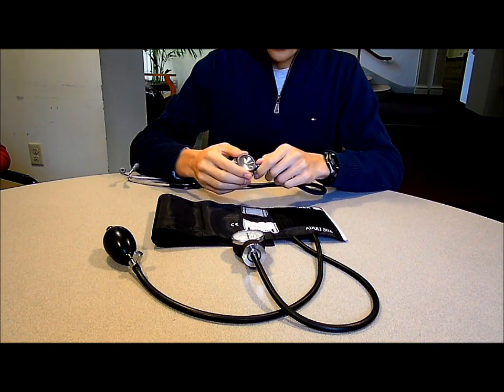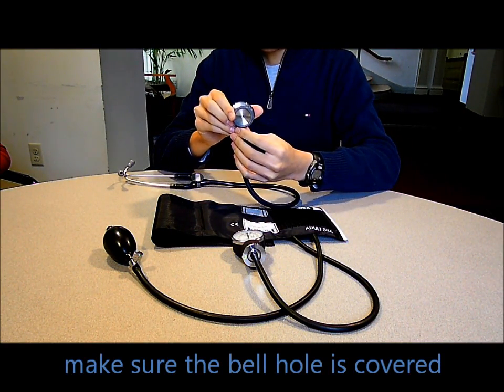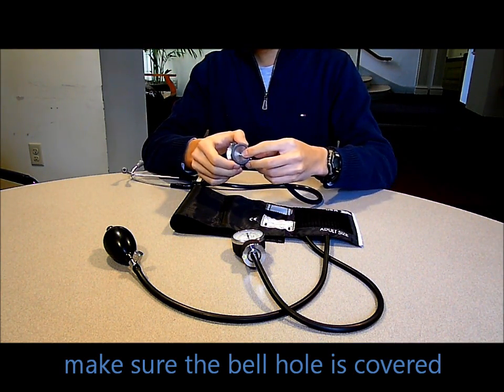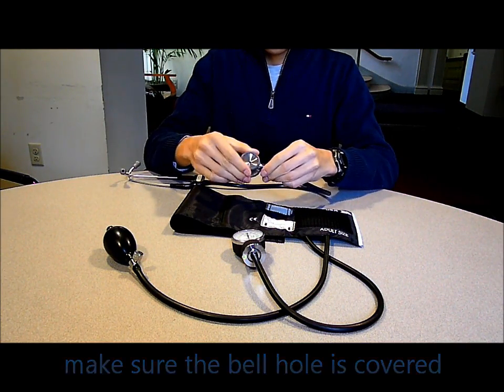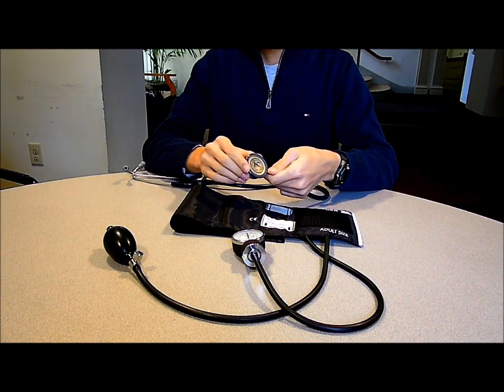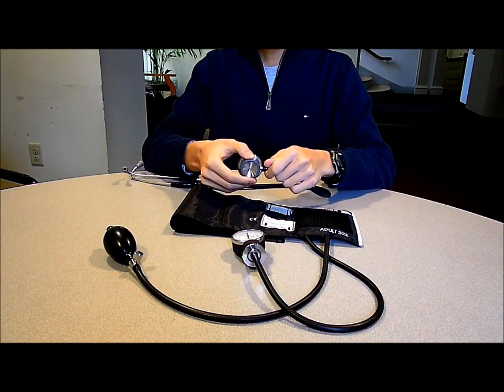So make sure that when you look at it, the hole in the middle of the bell is covered. The stethoscope can only use one side at a time, and so when the bell side is covered, this means that the diaphragm is active. If you twist it and the bell side is open, the bell side is active and the diaphragm is inactive. So for our purposes, make sure that the diaphragm is active and the bell side is closed.